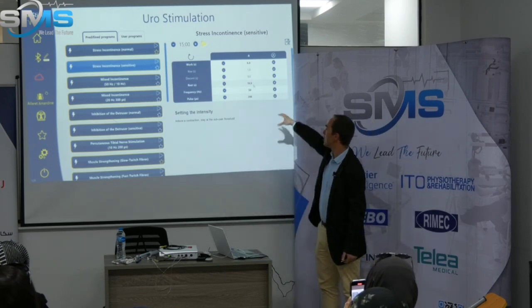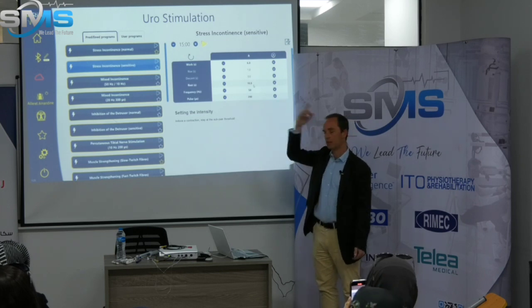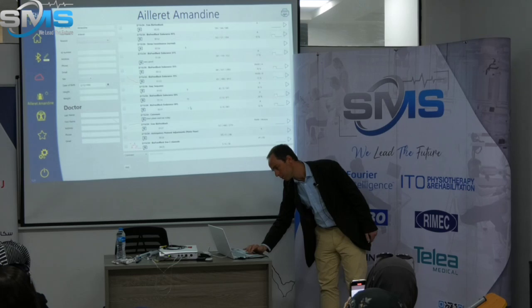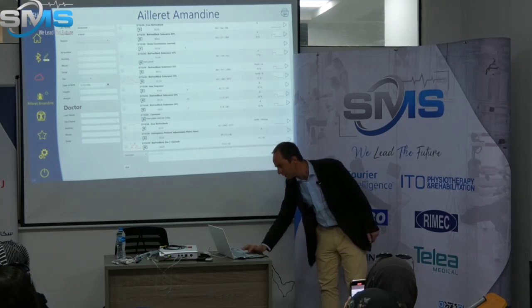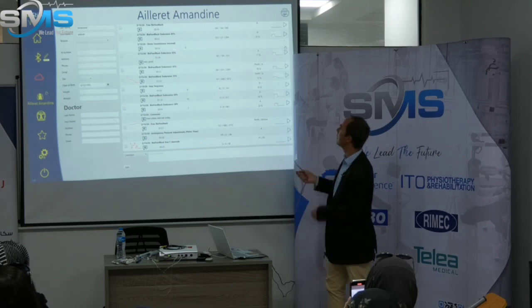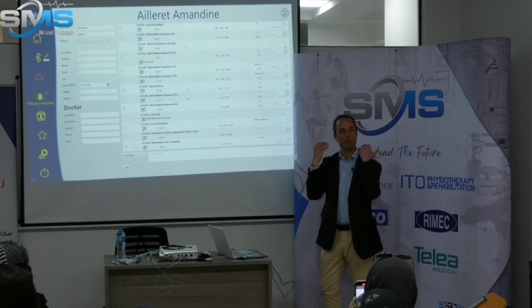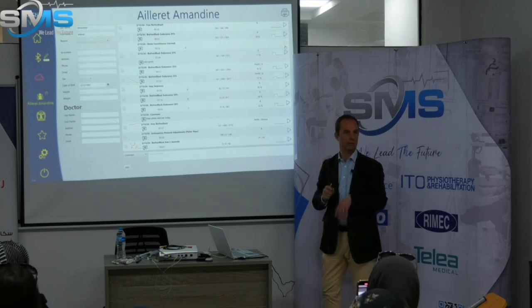If I did this adjustment for my patient, next time she comes, I will get back her patient file. I will find the session I did. I will restart, for example, up here, stress incontinence. I will restart from here, and I will just get back all the parameters that I adjusted for her.